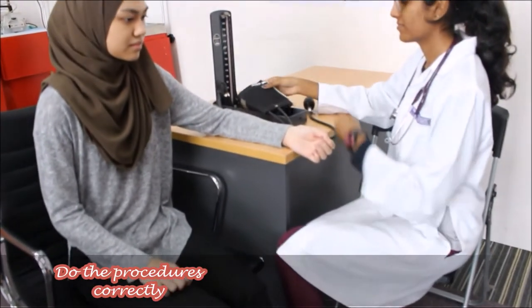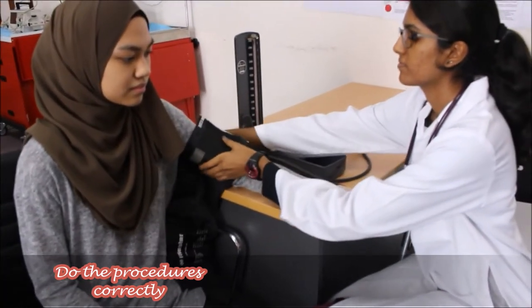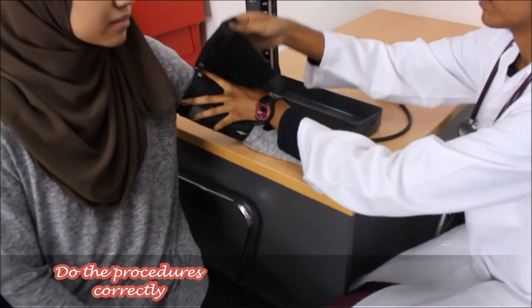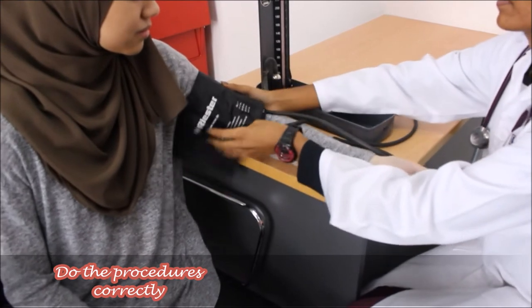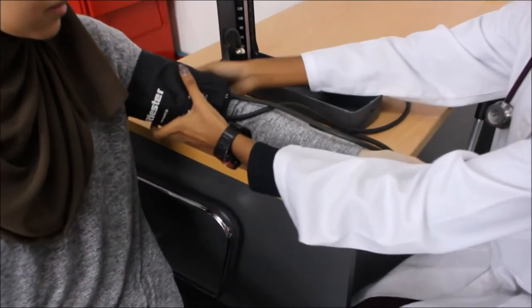Next, wrap the cuff above the elbow of the patient by approximately 2-3cm. The cuff should not be too tight and the doctor should be able to slip two fingers into the cuff.